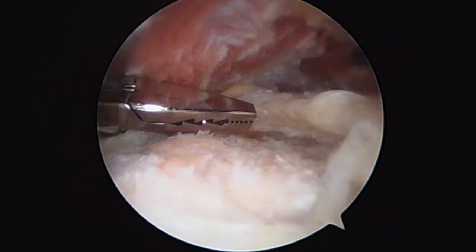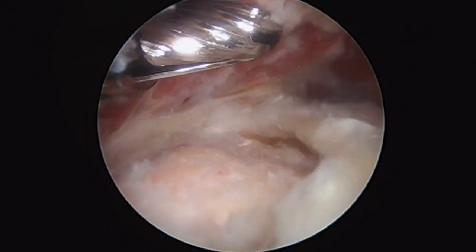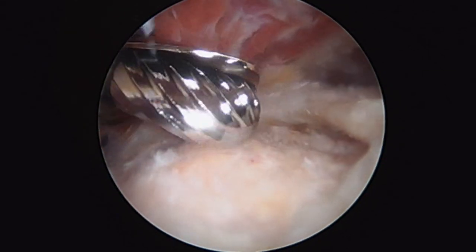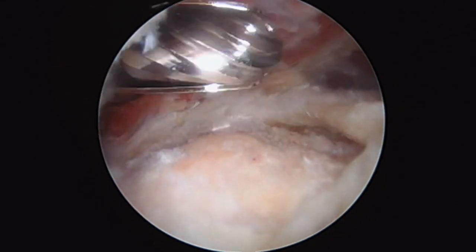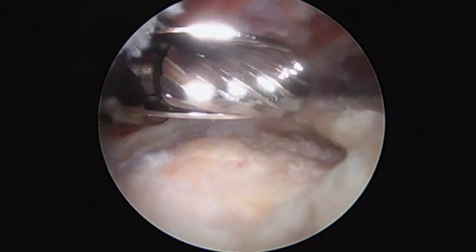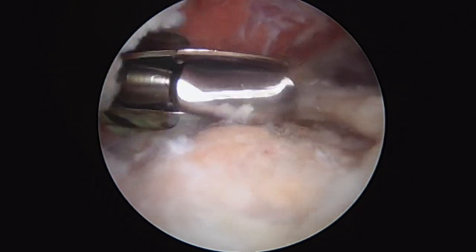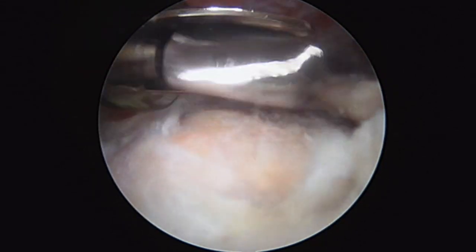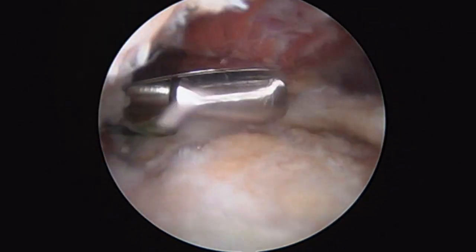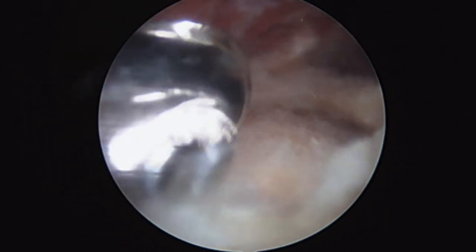But that's why the patient's here, and that's what we're going to do — we're going to show you how we do it right now. Step number one is preparing for our repair. This is a burr, and what I'm going to do is just gently decorticate this bone. What that allows for is some bone marrow constituents to leak through the bone back into the tendon, and allows the tendon to heal down into the bone once we've repaired it. I turn the burr on here — we're going in reverse, which is just a little bit more gentle on this tissue — and I gently remove all of this remaining soft tissue, so that once we've repaired the cuff, it's got a good chance to heal back down into the bone where it once was.